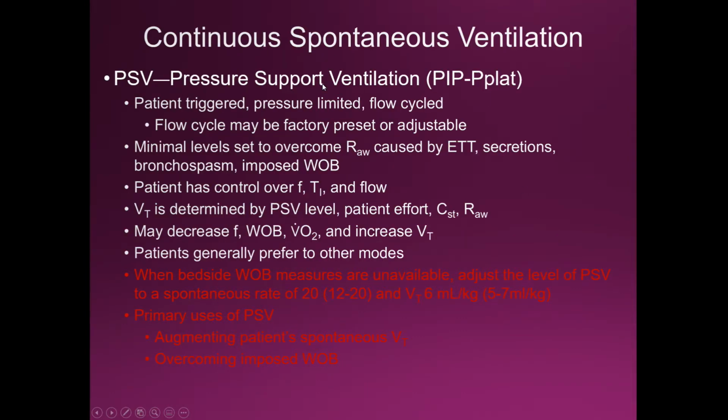All right, so when we talk about pressure support ventilation, now it says PIP minus plat on the side, and that is going to be, let's kind of see what's going on here. Patient triggered, okay, pressure limited, okay, because we are in the pressure support, and flow cycled.